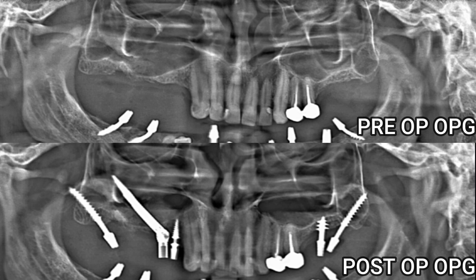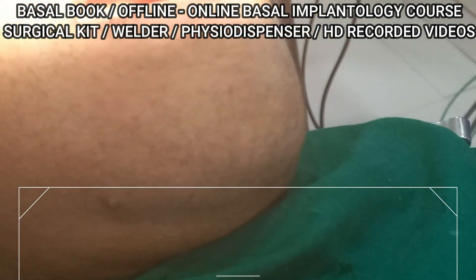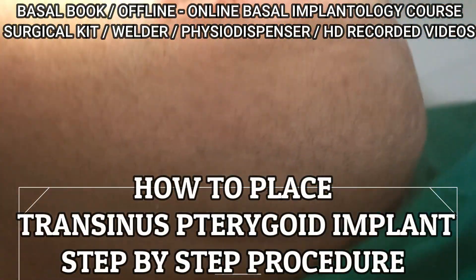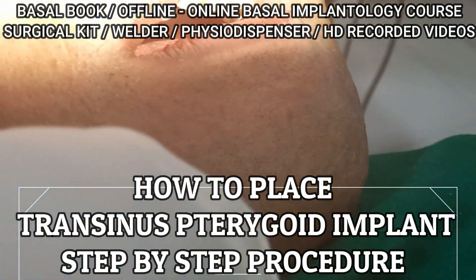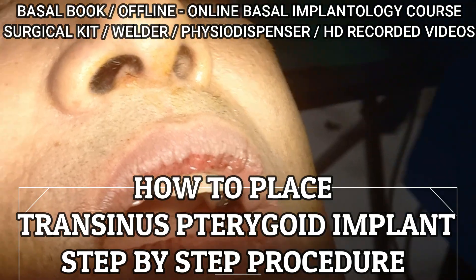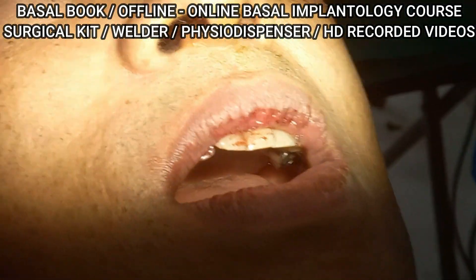I am just showing you this case if you want to. I will share the OPG on the WhatsApp.